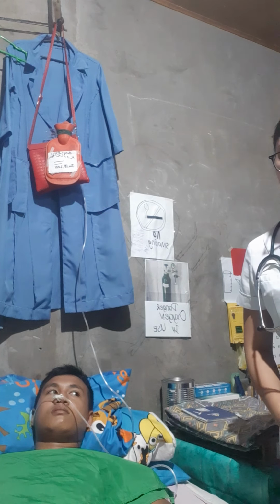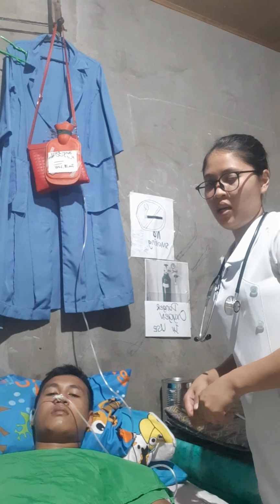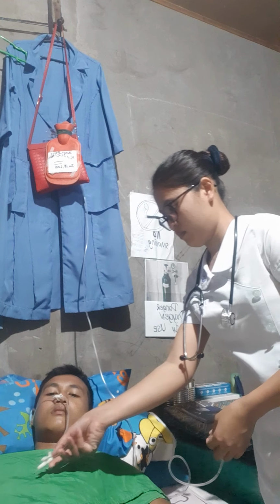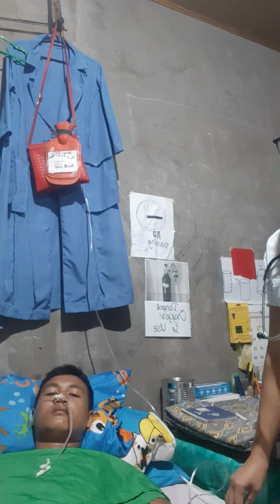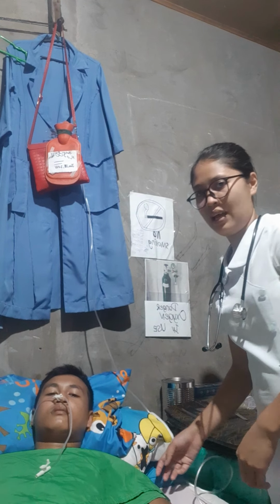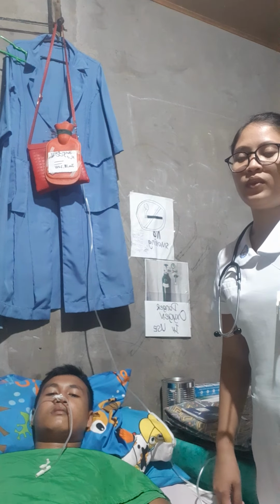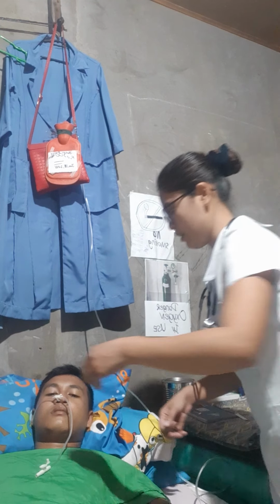Then afterwards, we are going to detach the tubing. So, disconnect first the nasogastric tube from the suction apparatus, and then afterwards, unpin the tube from the client. Afterwards, remove the adhesive tape from the nose of the client.